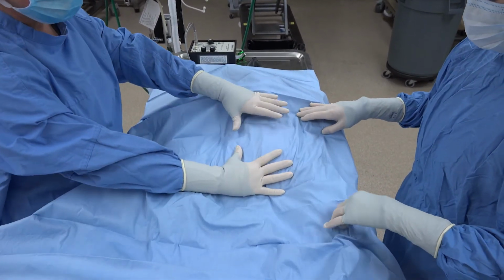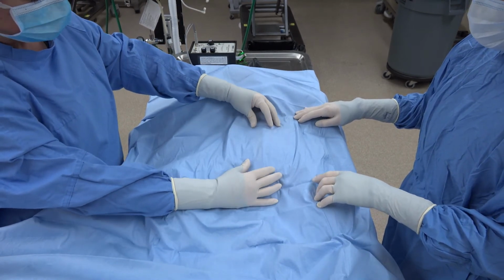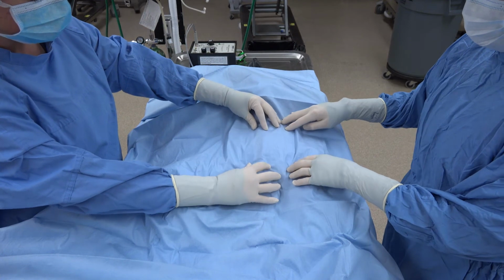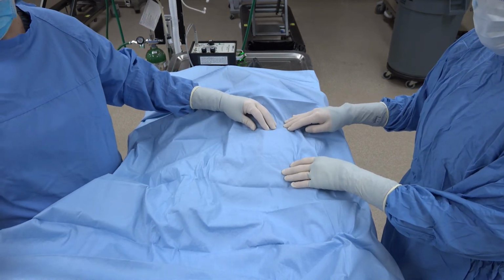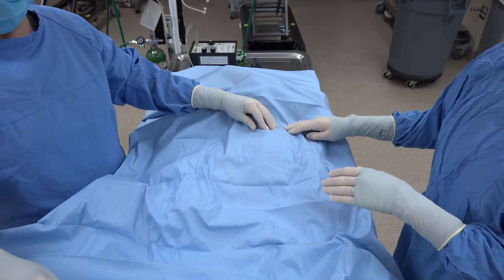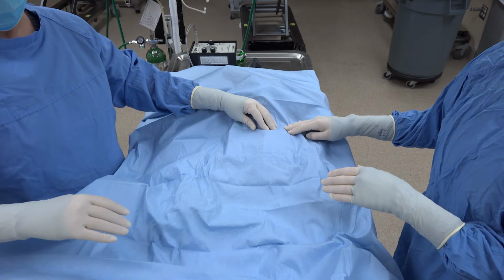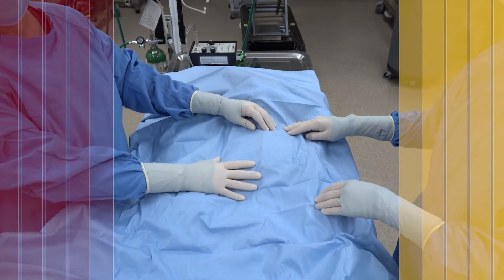All right, so now we've got our dog. I can feel the towel clamps under here, under the table, so I know where my incision needs to be and where to cut the hole in the drape. And we can put the blade handle on the blade and get the instruments ready that we are going to use and set them out and get started with the spay.